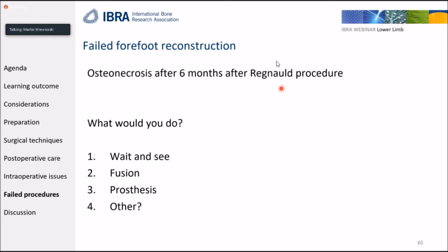I don't know, if it's the same about the chevron osteotomy. I'm really surprised that I do it even in the more severe hallux valgus up to 20 degrees, as I told you, and even with the basically uniplanar osteotomy, which I always do a little bit, I would say around 30 degrees plantarly, then I see a correction actually of the rotation. So when looking at X-rays and intraoperatively, I think you can even achieve with this kind of uniplanar osteotomies a sufficient correction of the rotation.